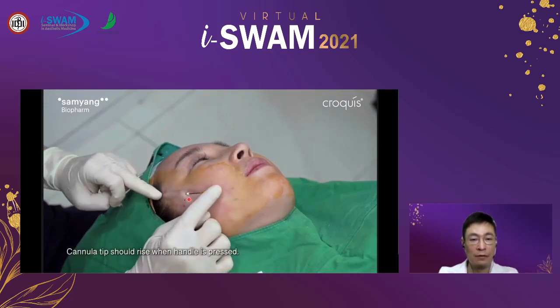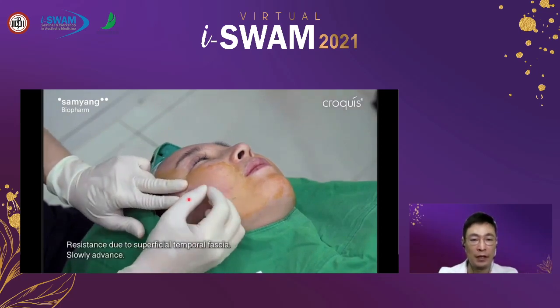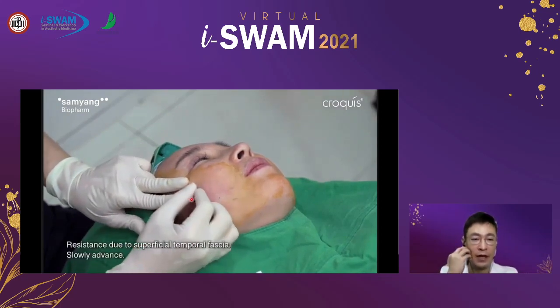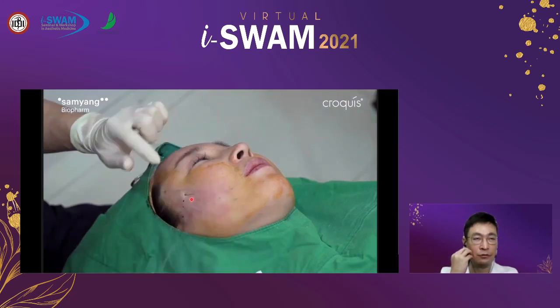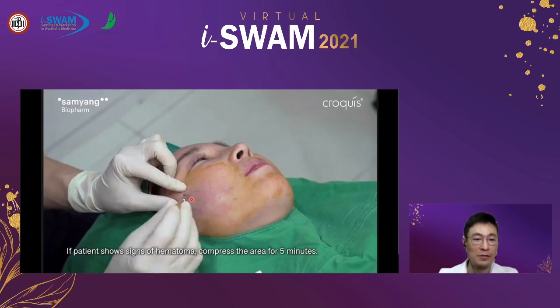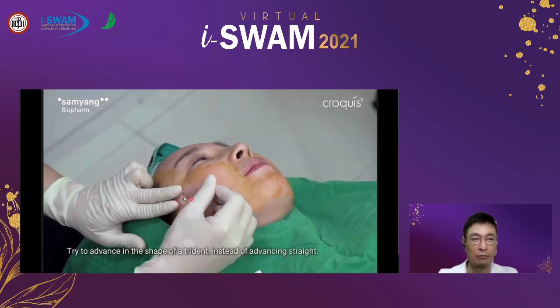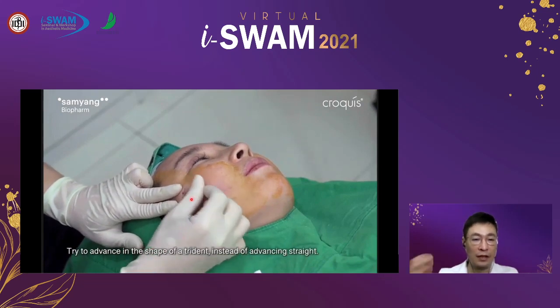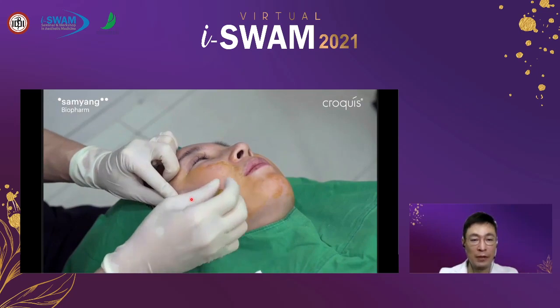For those who have already too widened cheekbone, or if this area is too thick, or there's too much fibrotic change inside the skin, sometimes it's very difficult to advance the thread in the proper layer. Then I can use an alternative treatment method.